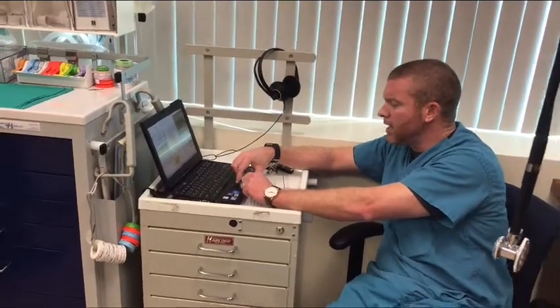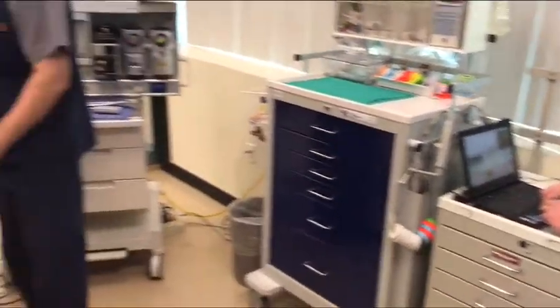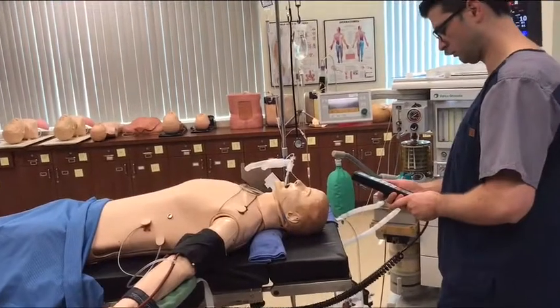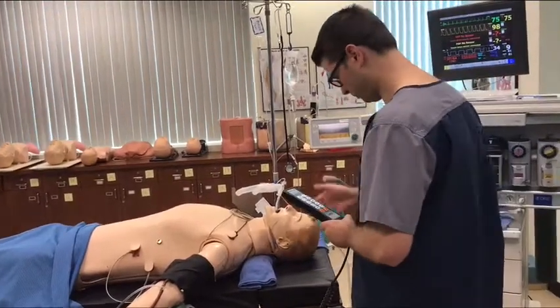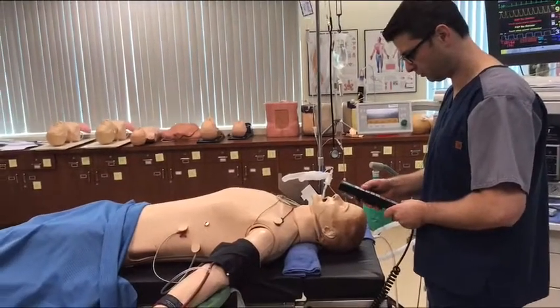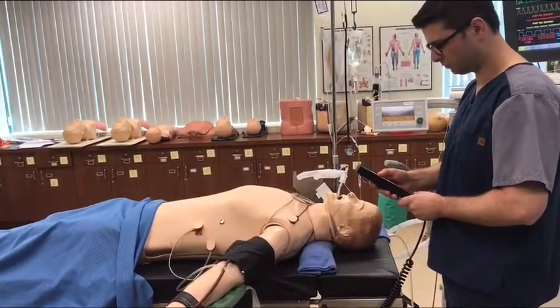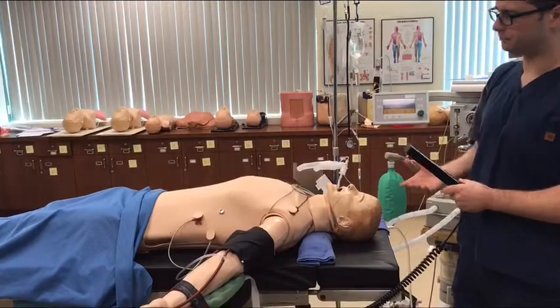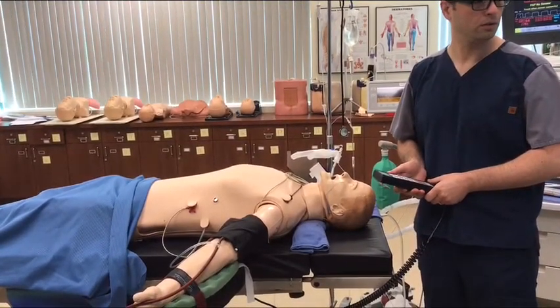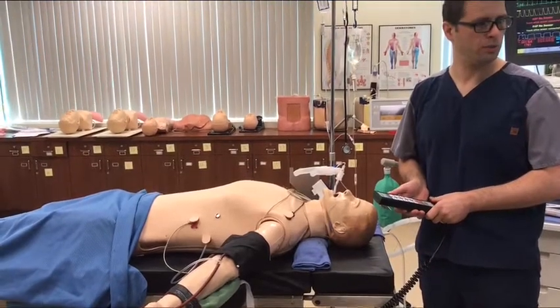All right, can you please position the patient? We're going to try to establish a pneumo right now. How are we going to position the patient? First it's reverse Trendelenburg. No, that's Trendelenburg. Don't we turn the patient a little bit?